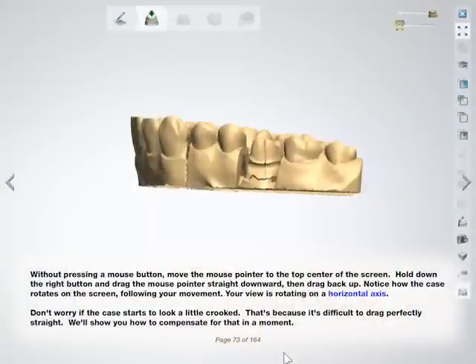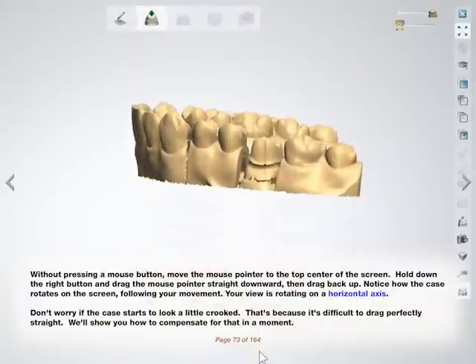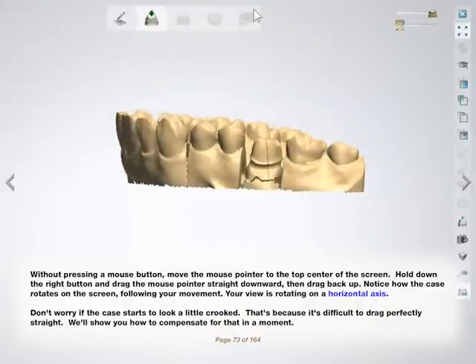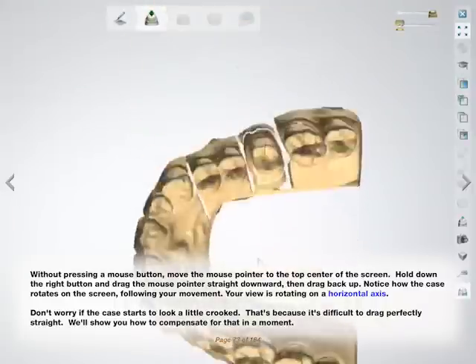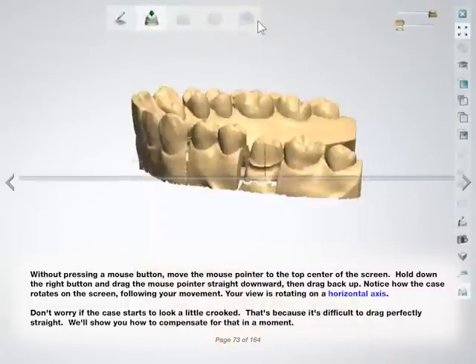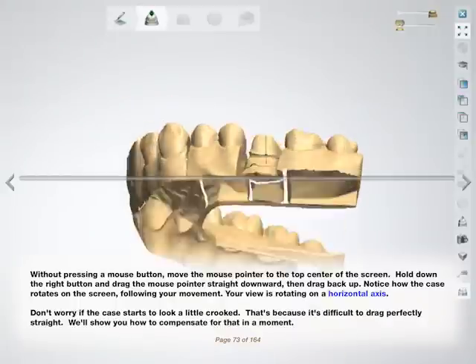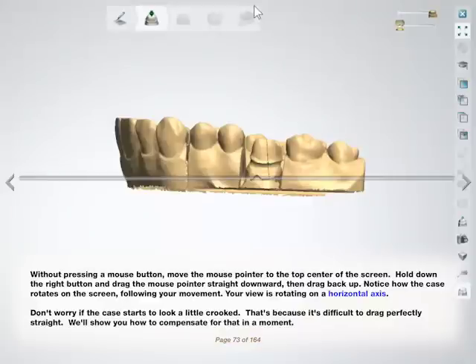Without pressing a mouse button, move the mouse pointer to the top center of the screen. Hold down the right button and drag the mouse pointer straight downward, then drag back up. Notice how the case rotates on the screen following your movement. Your view is rotating on a horizontal axis. Don't worry if the case starts to look a little crooked — that's because it's difficult to drag perfectly straight.